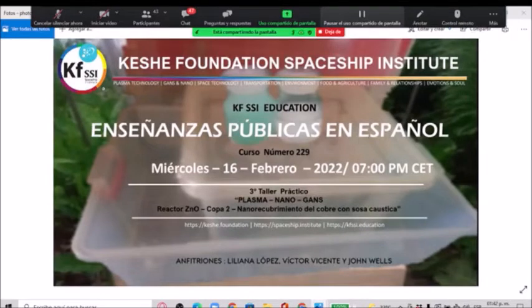We talked about the nano coating of gold or silver or other materials. Gianni has managed to do it because he works with dental works. But the most important thing is to work with the 4 basic ganses, with which you could do 90% of all your works.